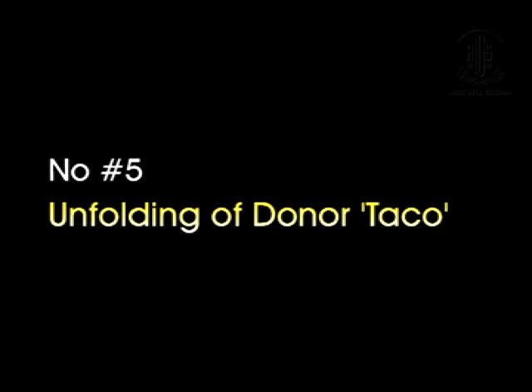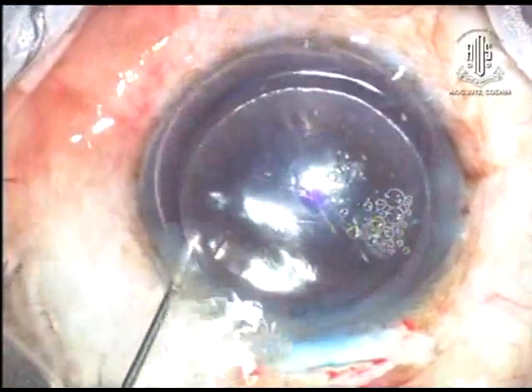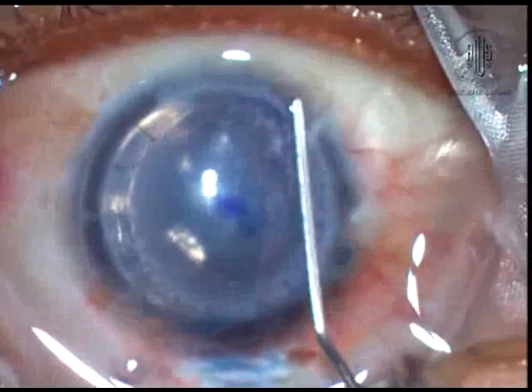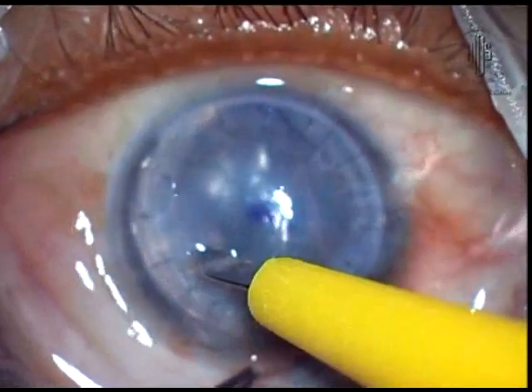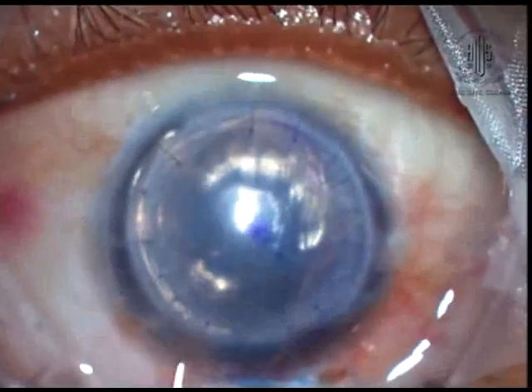Number 5. Unfolding of the donor tissue. It is not easy as in routine DSAEK cases. BSS and air from the side ports do not help all the time. Some cases it may open halfway. External manipulation is then required and further air injection helps in complete unfolding.